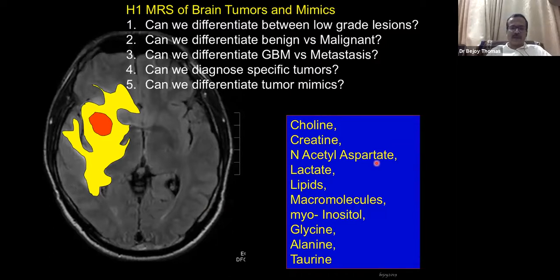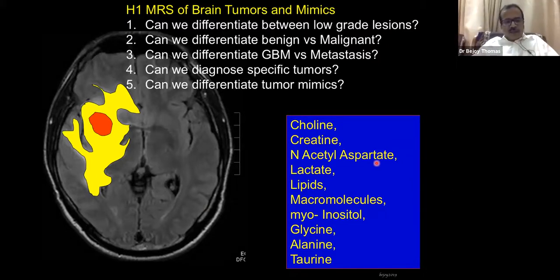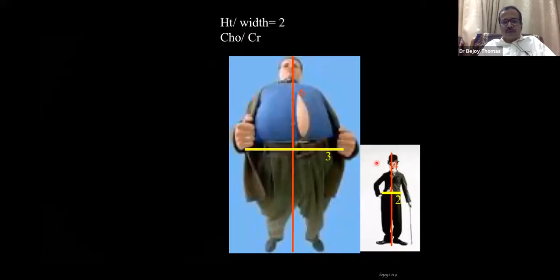I'm not saying that it cannot, it can, but more important and more interesting MR imaging methods have been developed, like diffusion tensor and perfusion, which have actually surpassed the usefulness of spectroscopy, in my opinion. And there are hardcore spectroscopy fans, and I'm not a real fan now, because I was a fan in 2005-6, but not for brain tumor classification.